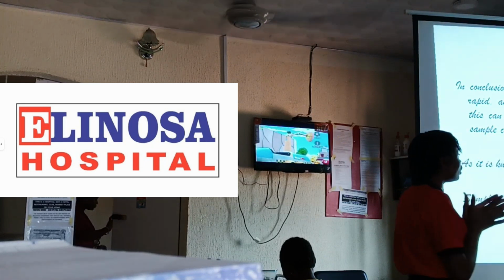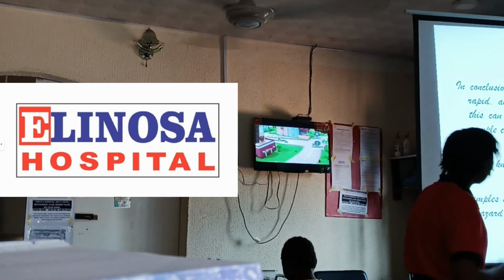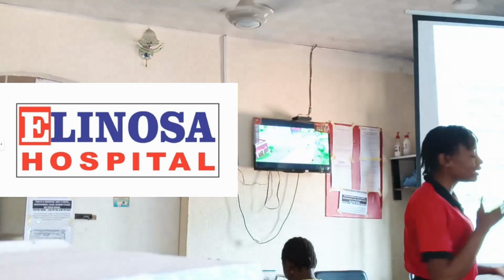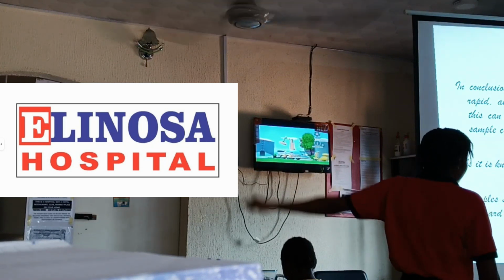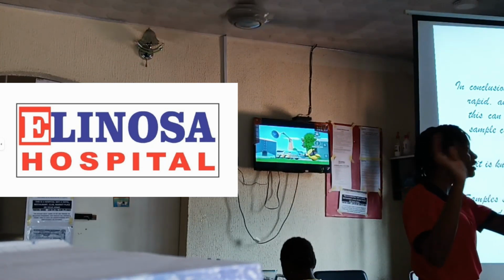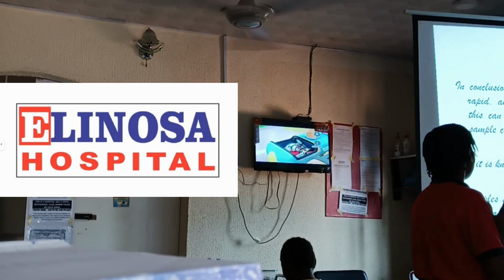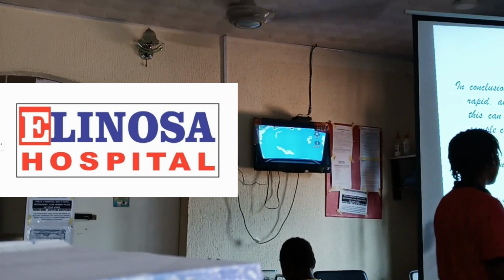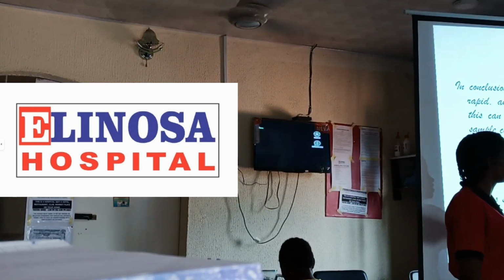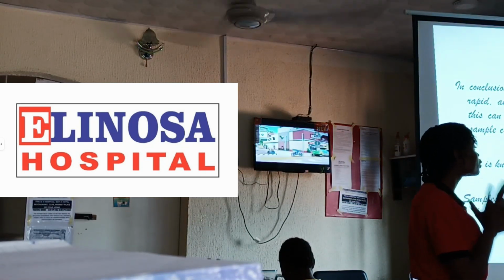So please, when you collect a blood sample, don't shake it, it will hemolyze the blood. When you collect blood or urine and it's not to be run at that particular time, store them in the refrigerator. Do not leave them on the bench waiting for the scientist or the laboratory technician. And lastly, samples should be treated as gold and handled as a biological hazard that could save life.